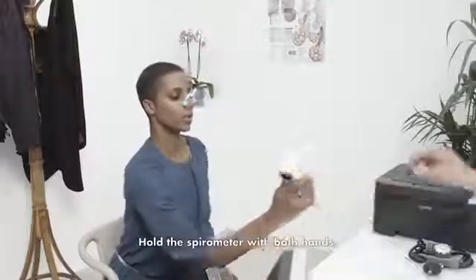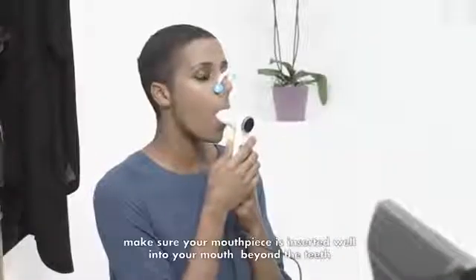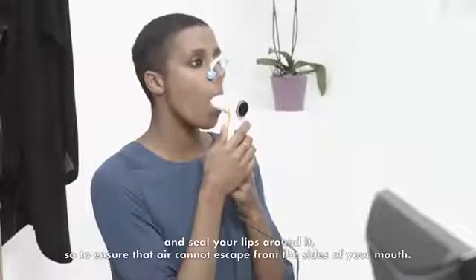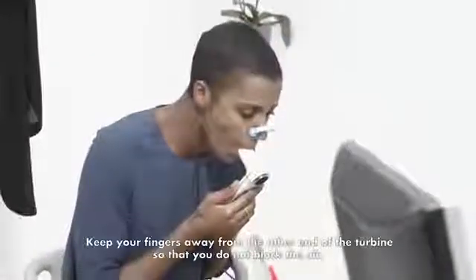Hold the spirometer with both hands. Make sure your mouthpiece is inserted well into your mouth beyond the teeth, and seal your lips around it, so to ensure that air cannot escape from the sides of your mouth. Keep your fingers away from the other end of the turbine, so that you do not block the air.